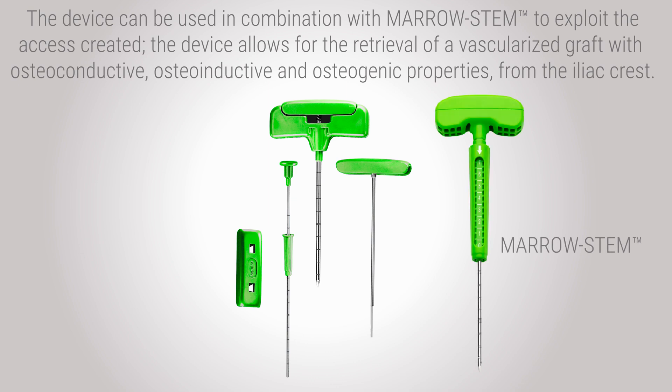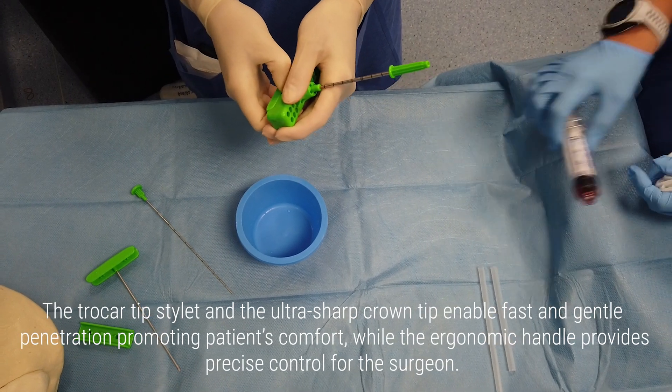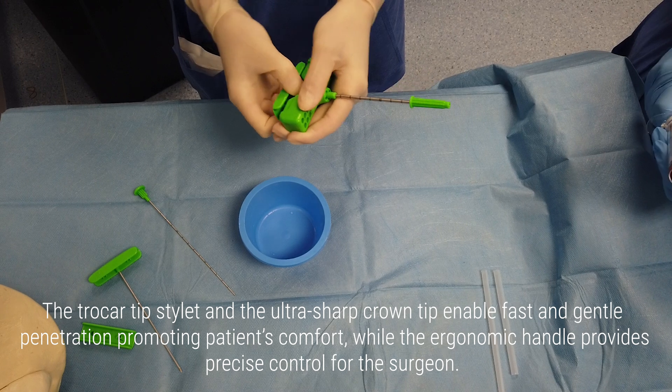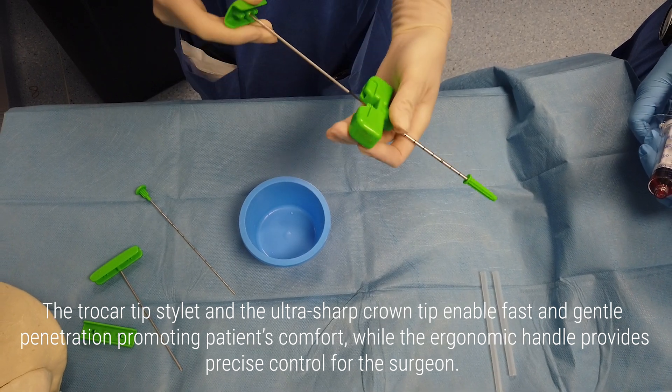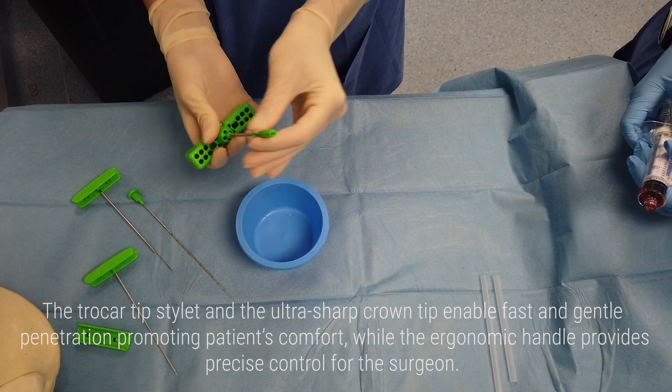The device allows for the retrieval of a vascularized graft with osteoconductive, osteoinductive, and osteogenic properties from the iliac crest. The trocar tip stylet and the ultra-sharp crown tip enable fast and gentle penetration, promoting patient comfort, while the ergonomic handle provides precise control for the surgeon.